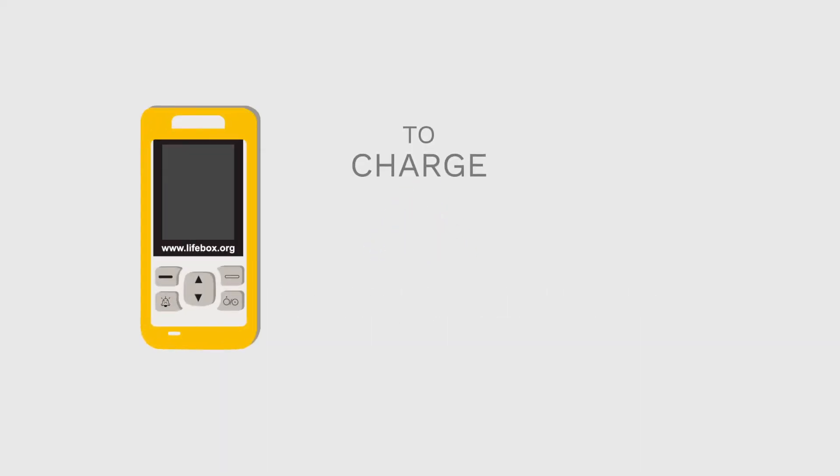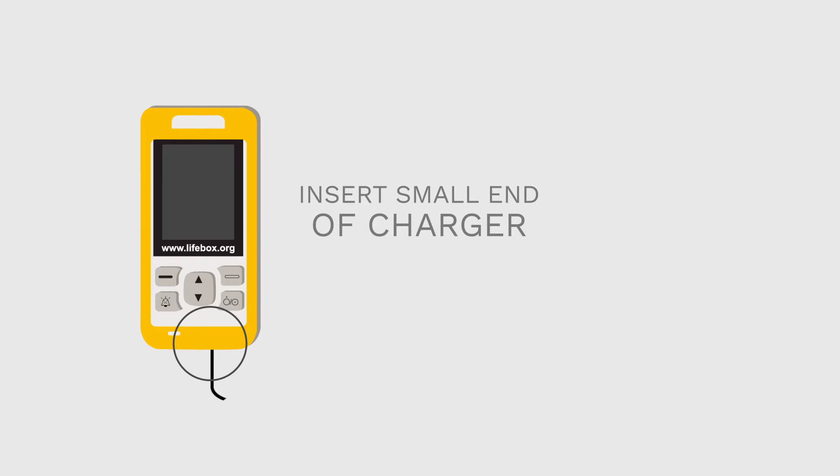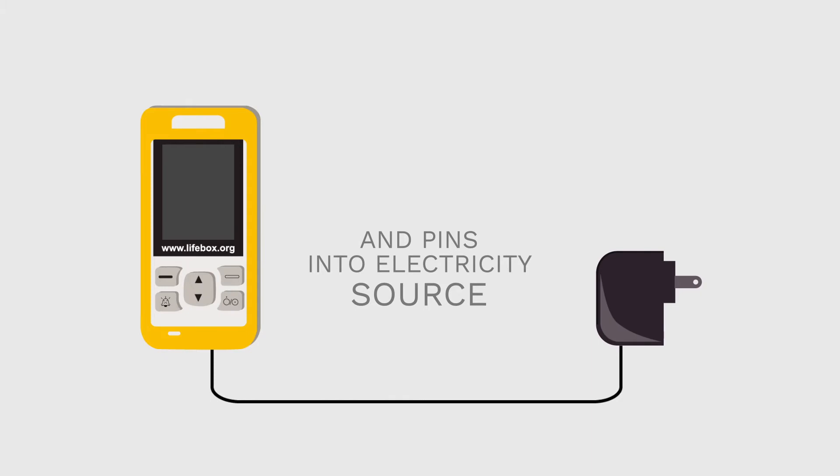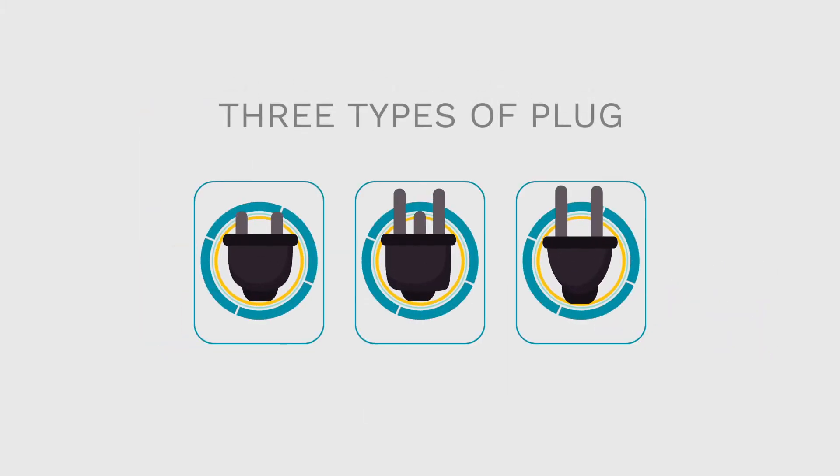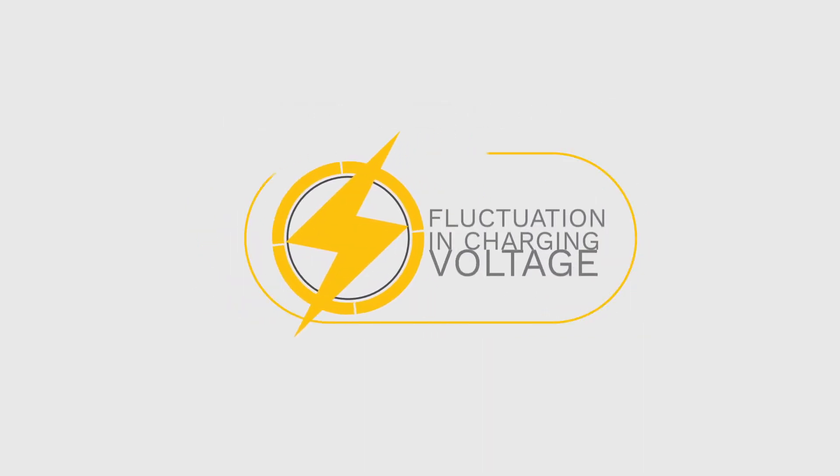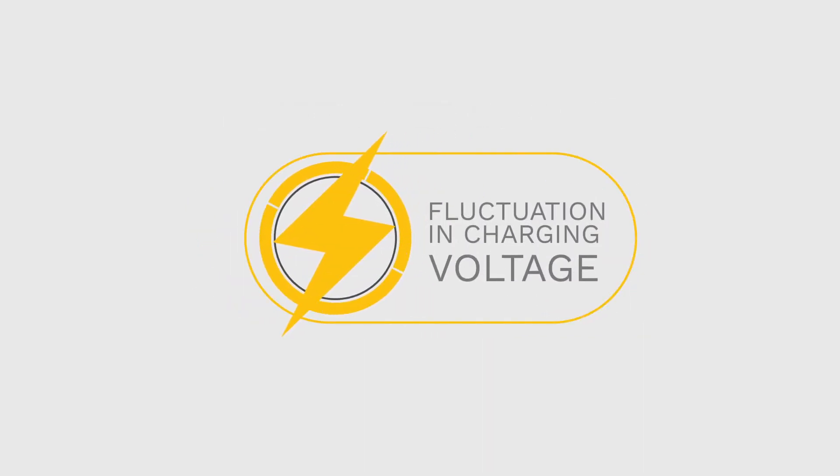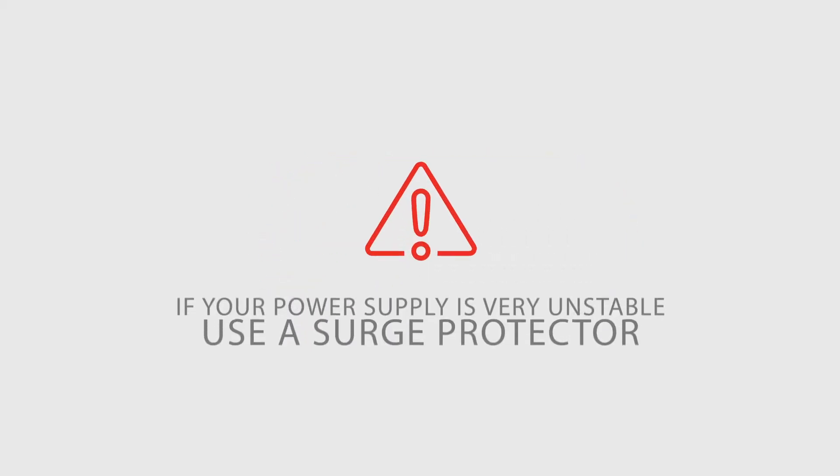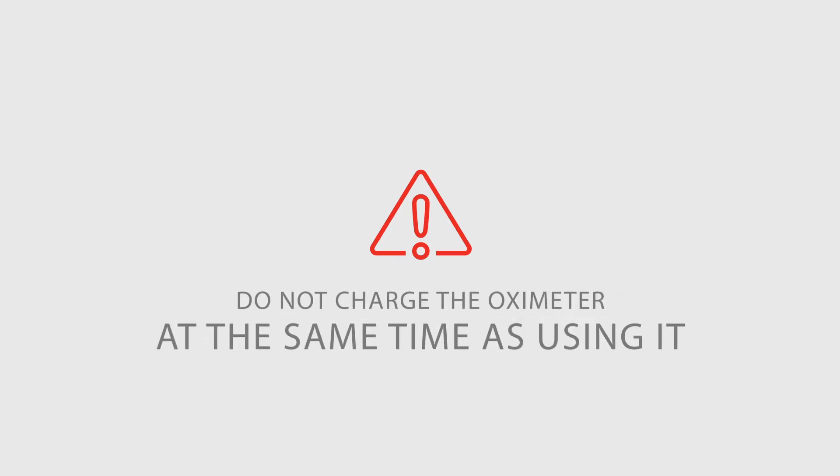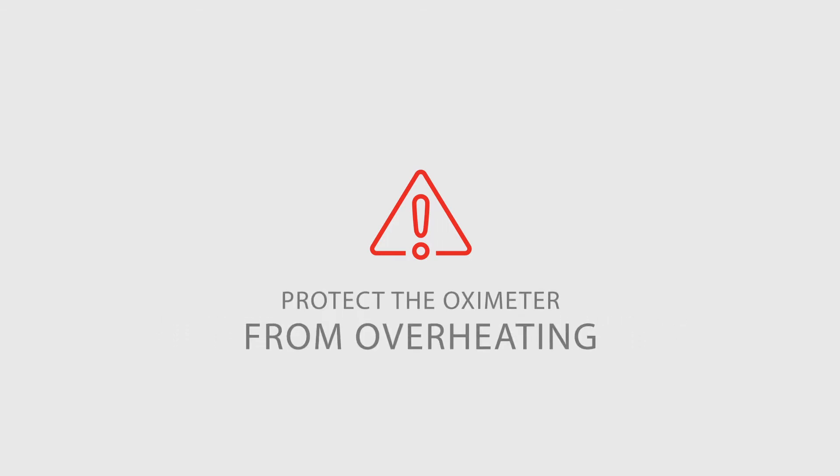To charge the oximeter and battery, insert the small end of the AC-DC charger into the bottom of the oximeter and the pins into an electricity source. The Lifebox charger comes with three types of plug. Depending on which region you're in, you may need to remove the pins from the base of the charger and replace them with another set. The oximeter can handle some fluctuation in charging voltage, but current surges may damage the machine over time. If your power supply is very unstable, use a surge protector if possible and do not charge the oximeter at the same time as using it. In this way, you will protect the oximeter from overheating.